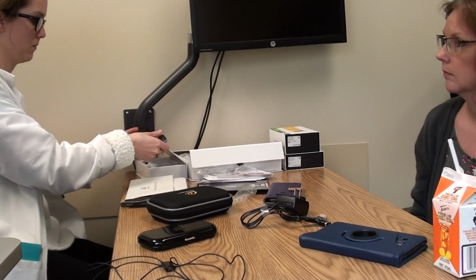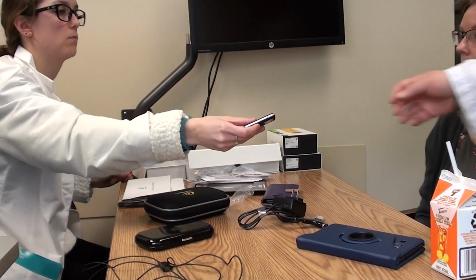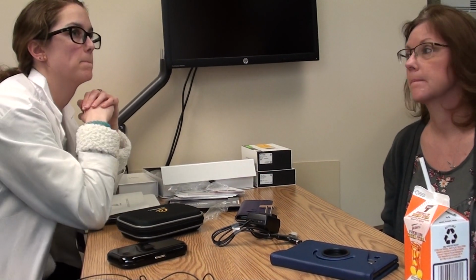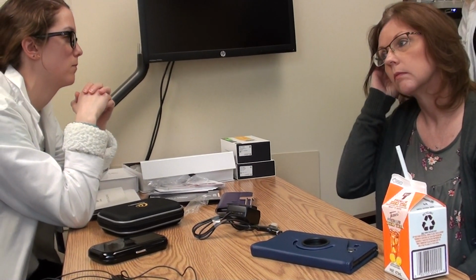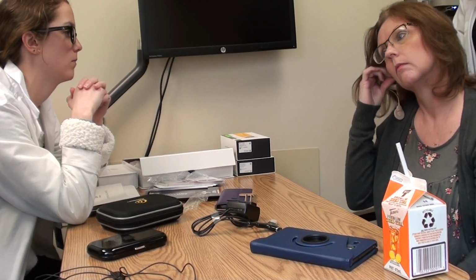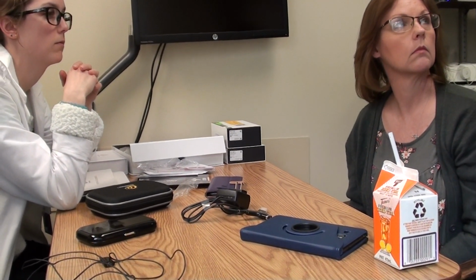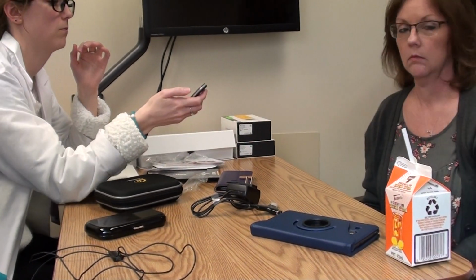You remember how to pair the remote, Becky? Yes. No, you just turn it on and put the coil on the back of it. You just take that off of her head. And all you have to do is just look at the screen, and it'll say P1. It should say P1. Yep, that's paired. Good. Here you go.